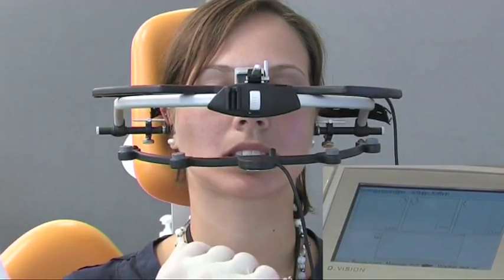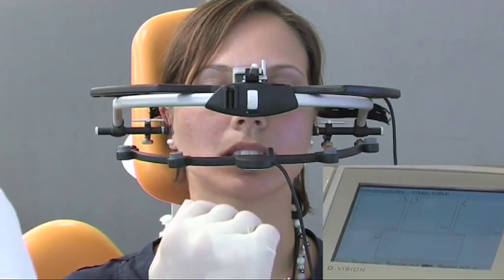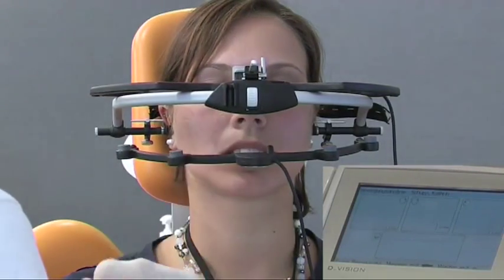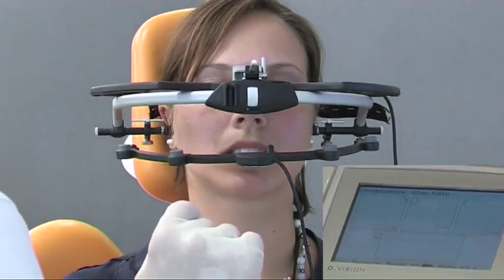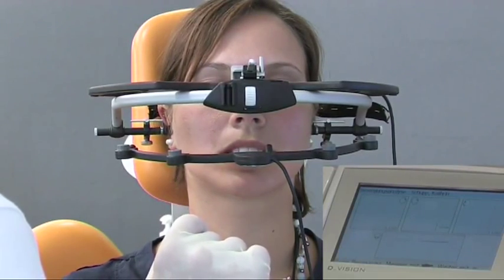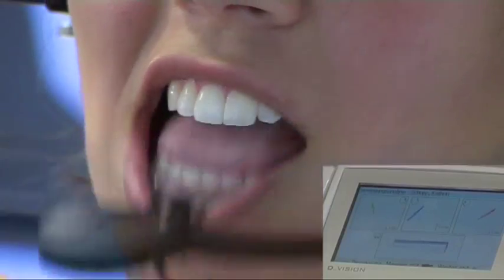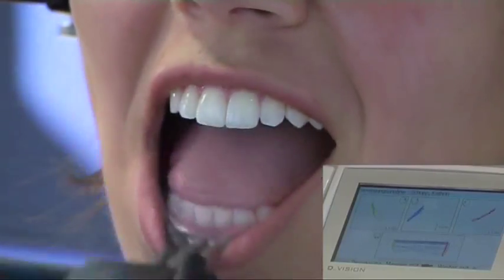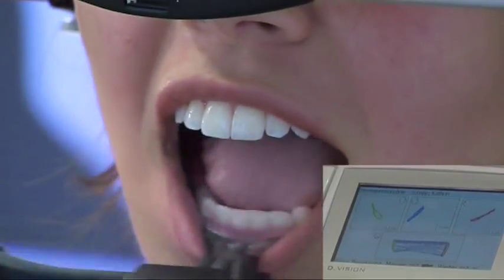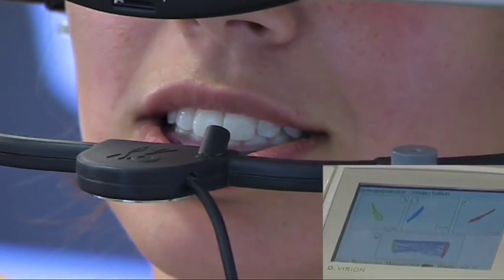For the last recording, we allow the patient to carry out a chewing exercise. Please chew as if you had a piece of chewing gum between your teeth. Now chew well to the side.